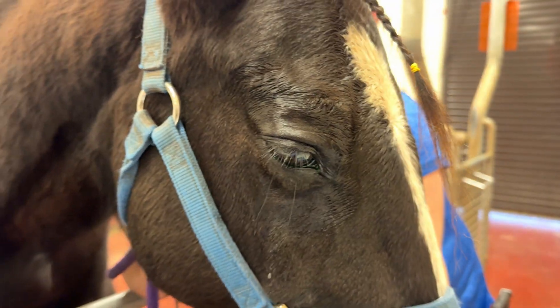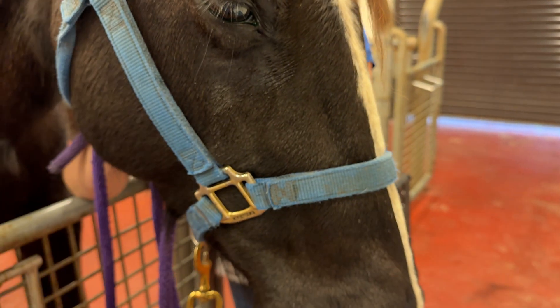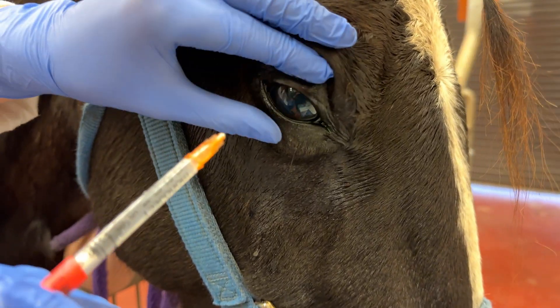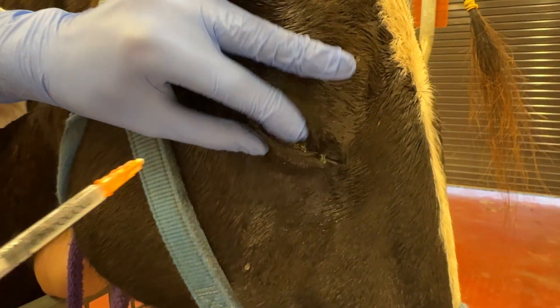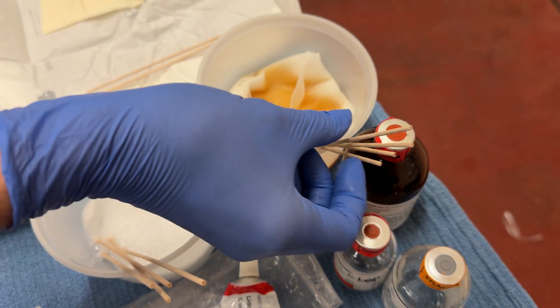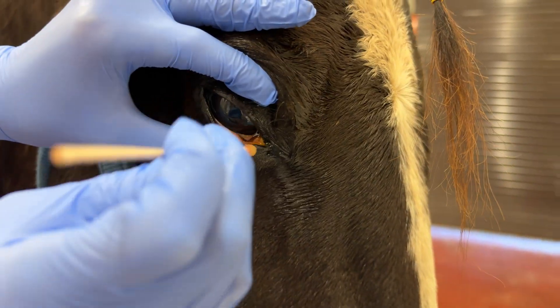Next we're going to place proparacaine onto the eye. I pulled it up into the syringe. That's to numb the surface as well. And then I'm going to clean out the conjunctival sac with betadine.